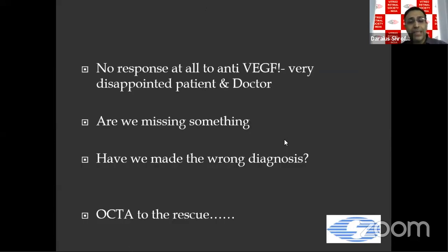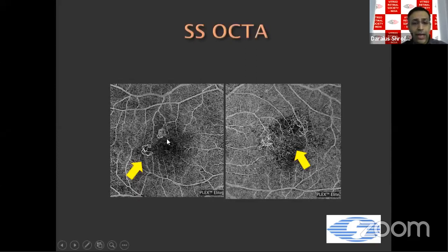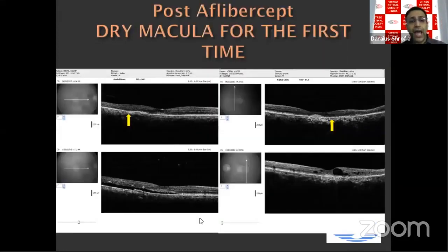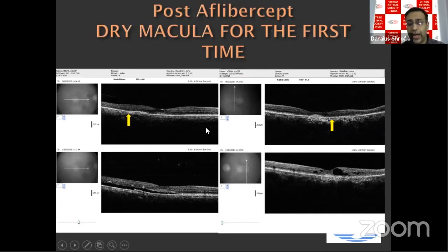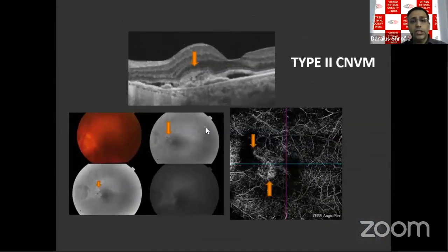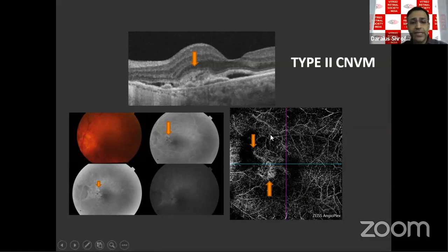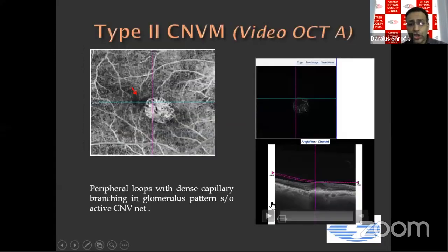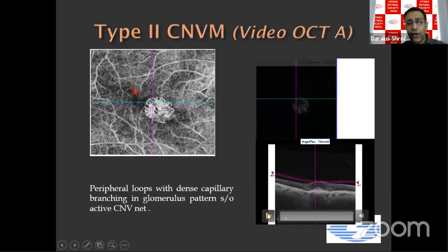OCTA came to the rescue — swept-source OCTA beautifully demonstrated the capillary groups and the membrane underneath. Choroidal thickness was measured and found to be extremely thick; therapy was switched and the patient achieved a dry macula in both eyes for the first time. For Type 2 CNVM, the membrane lying spindle-shaped just below the retina is beautifully seen. A short video of the OCTA scan going through sections confirms the lesion is real and not an artifact.